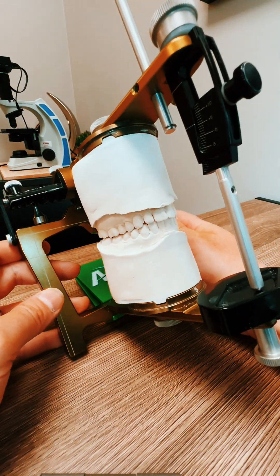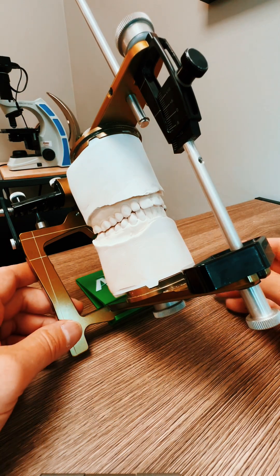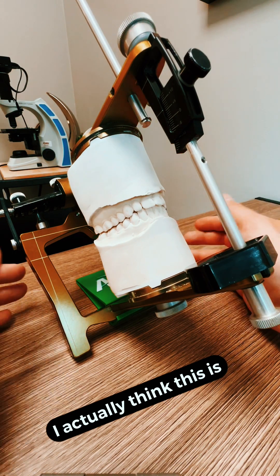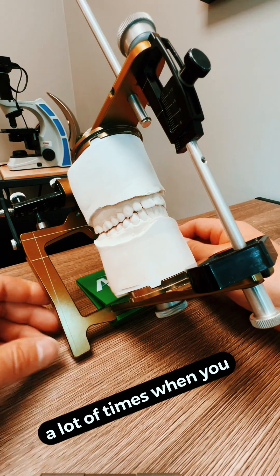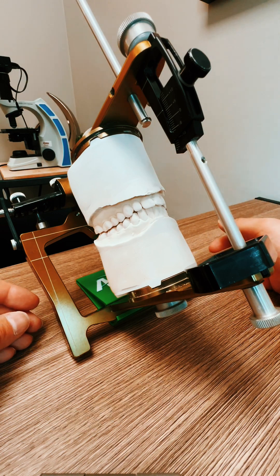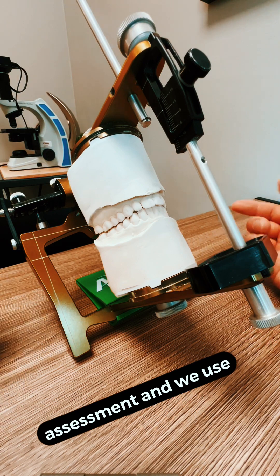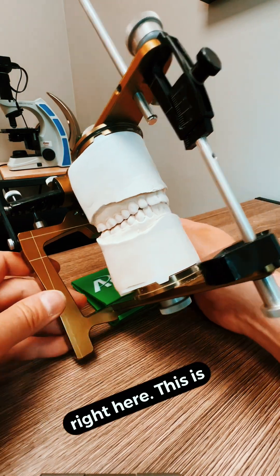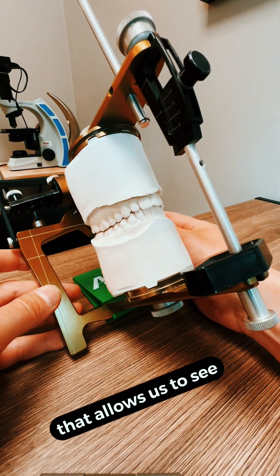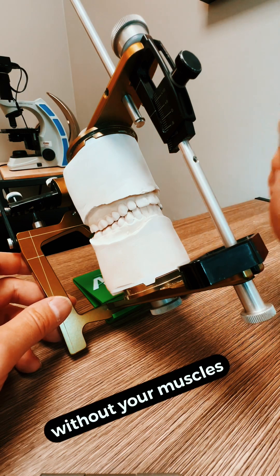Hey everybody, hope you guys are doing well. At the risk of losing all interest, we're going to do an addition of something I call 'more dentistry than you care to know about.' I actually think this is really important because a lot of times when you have a patient that comes in with muscle pain, tooth pain, TMJ, or TMD, we want to do an assessment and we use this tool right here. This is called a dental articulator. Basically, what an articulator does is it allows us to see what your teeth are doing during normal movements without your muscles getting in the way.